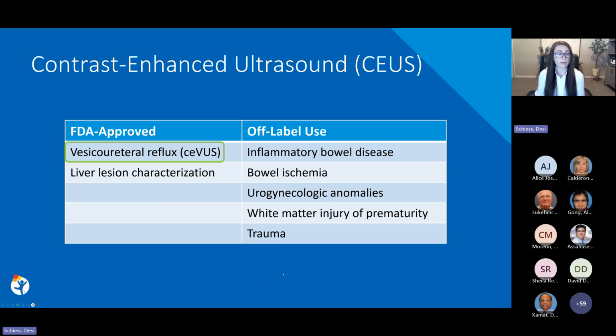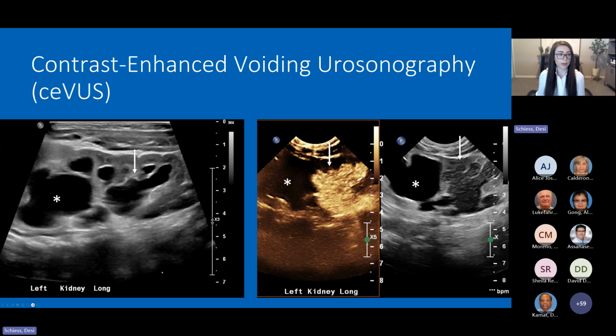There are also a variety of emerging uses for contrast ultrasound that are not yet FDA approved. Let's see an example of a CVUS exam. This 26-day-old female had a prenatal history of a duplex kidney.